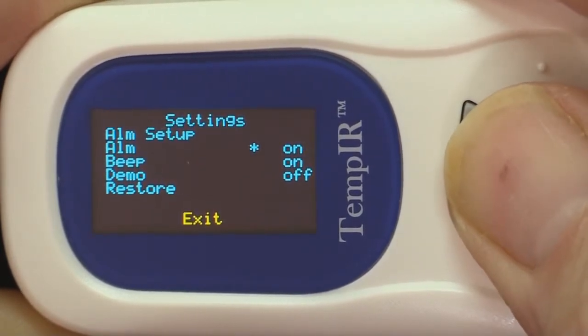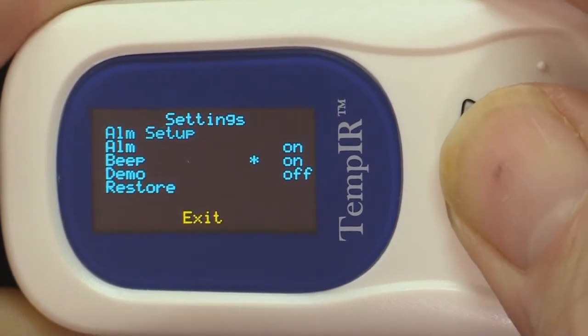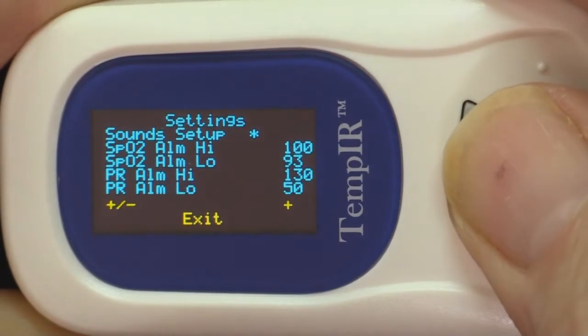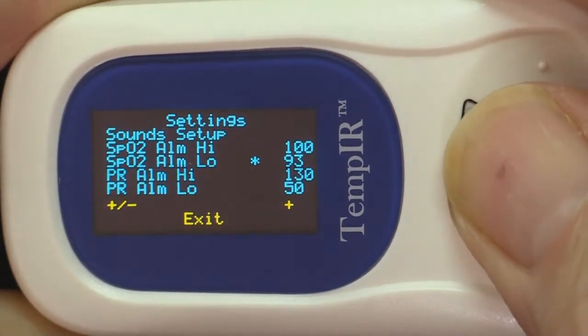Here we are turning the alarm off and on. Further short presses will move the cursor again. Access the alarm setting menu with a longer press, then once again navigate with short presses.